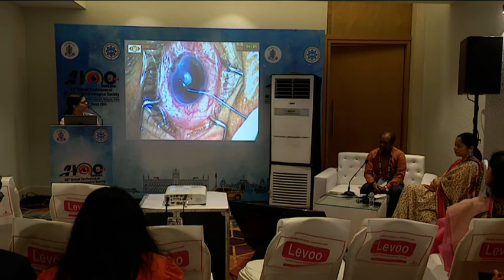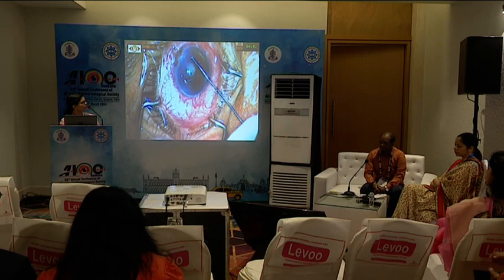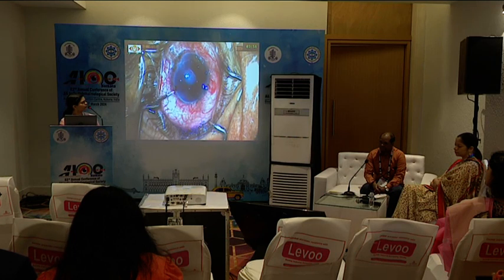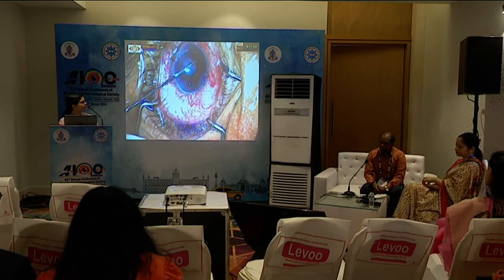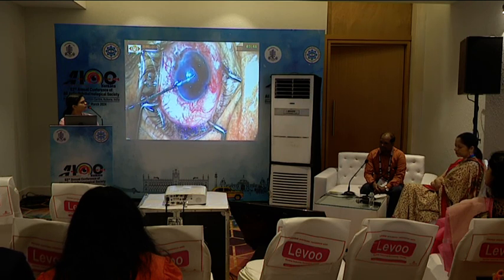After that, we performed pharmacological mydriasis by the use of intracameral adrenaline. But both attempts failed to dilate the pupil. So in order to dilate the pupil, we went ahead with the sphincterotomy.